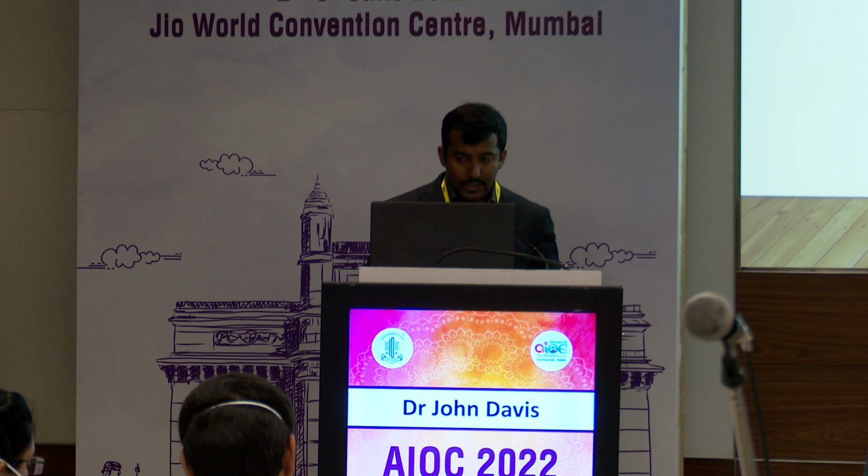We used the software Teachable Machine by Google, and we did it as an observational study. We had a small number, that is 58 fundus photographs of ARMD, BRAO, CRVO, macular hole, retinitis pigmentosa, subhyaloid hemorrhage from the database, and this was almost equal in number. One image from each category was randomly set aside for testing, and this Teachable Machine software was trained using the remaining 52 images. We tried with an epoch of 50, that is how long the training goes on for, and also 500. This was completed quickly, but then accuracy was not sufficient.